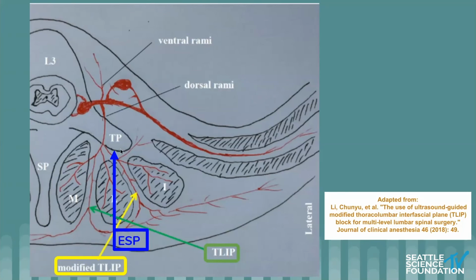of hitting bone in addition to the ultrasound guidance, if we use a basketball analogy, performing an ESP block is like doing a layup. Performing a Tlip block is like shooting a three-pointer. It's much more challenging, and in terms of making it very useful to many anesthesiologists, the ESP block is much easier to perform. So as a result, I think you would have much more consistent results with it than you would necessarily with a Tlip block.